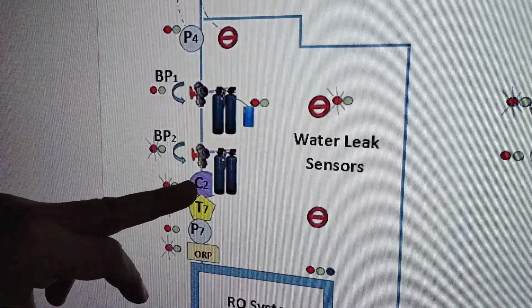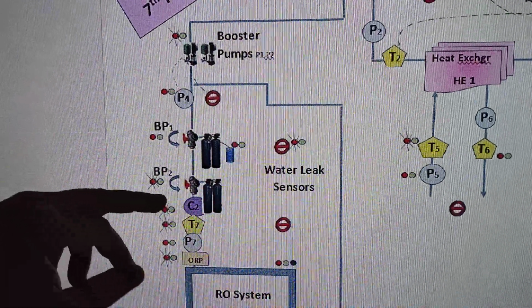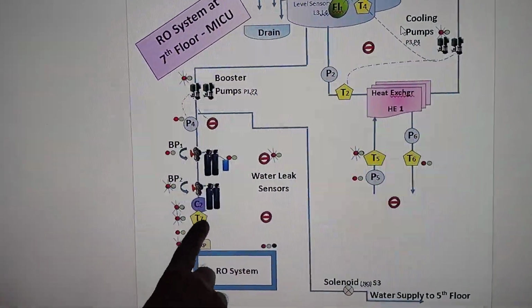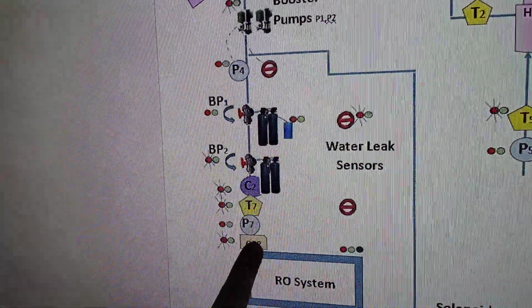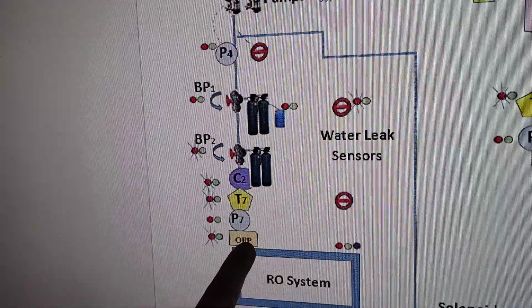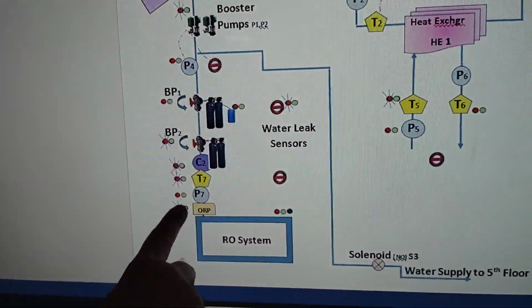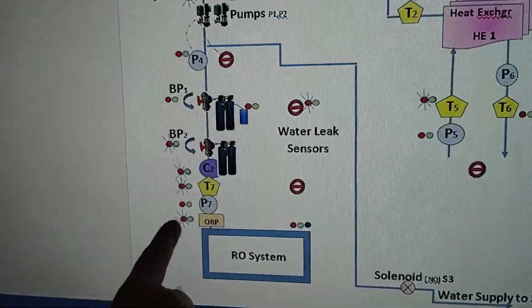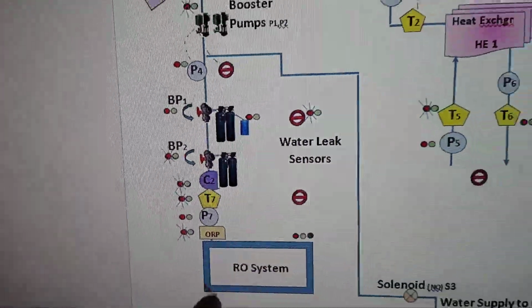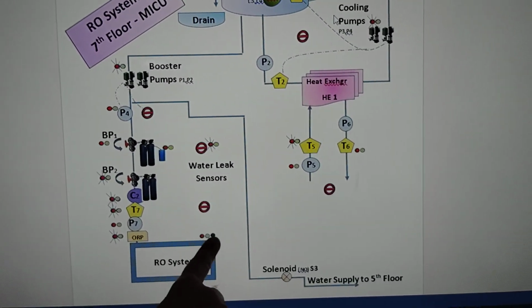Then comes the conductivity sensor. If the conductivity is very high, then again it has to give an alarm and try to maintain the conductivity. Temperature, pressure, and ORP sensors are there. So all these are being monitored over here before going into the RO system. If there is any chlorine level over here, it has to give an alarm over here. So the RO system works over here and gives the water supply to the dialysis unit.